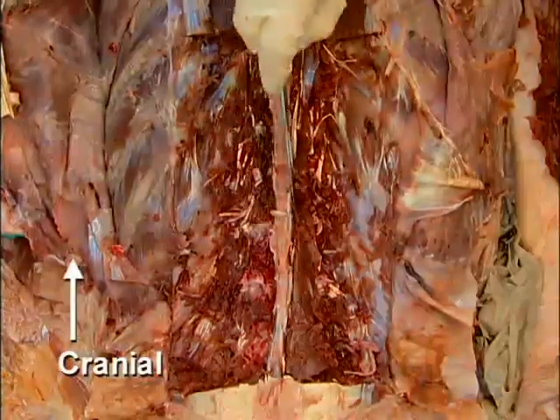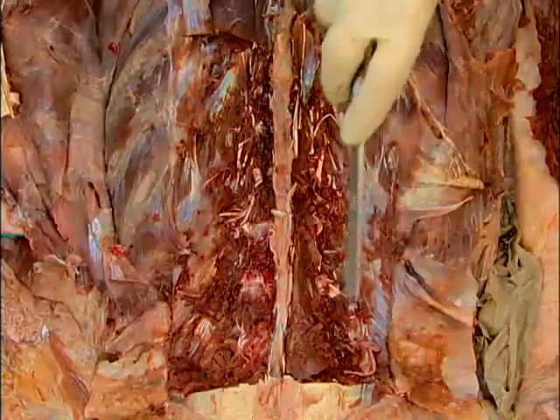With the transversal spinalis muscle on both sides of the spinous processes removed and the spinous processes and laminae cleaned, perform the laminectomy using a striker saw.